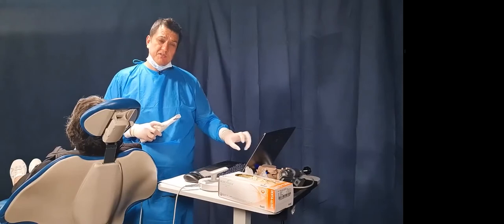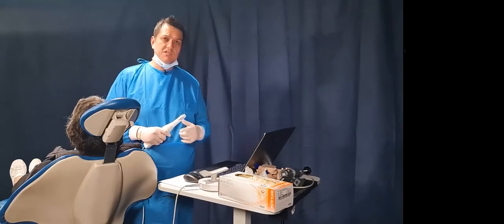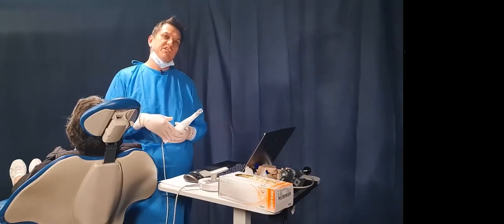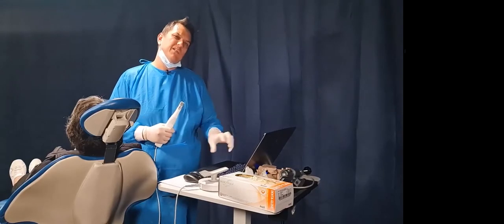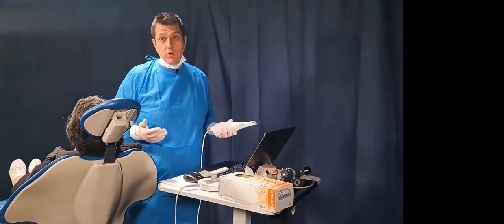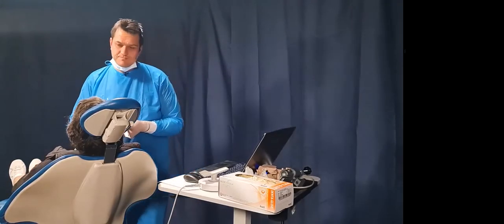On your Trios you do have several options for your scan strategies and protocol. I've selected just the edentulous arch scan, but what I'll show you directly after this is I've already done a PVS impression inside her current denture, and I'll teach you the reference denture scanning technique as well, and that is another little click button of itself. And those are really good assets for you to let the lab know what you want, what you're doing, and what you've got. It allows them to flip models and whatnot. So let's start with our scan.